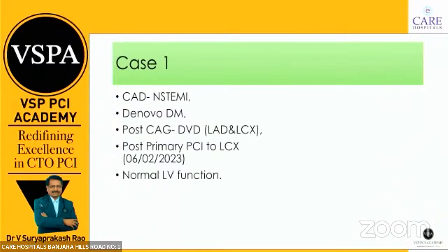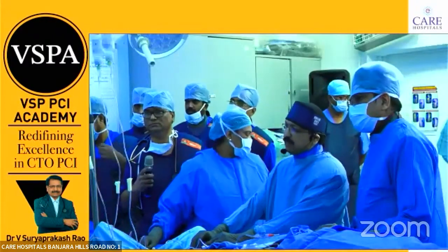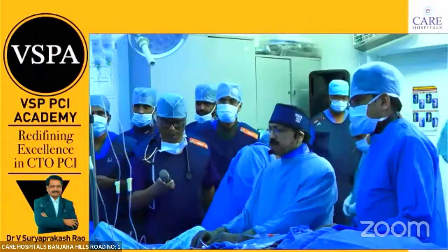The problem is he was stented in the circumflex in acute coronary syndrome at a different hospital. But at that time, the LAD CTO in the mid segment could not be profiled properly in different views to see exactly where it is. Now the dual injection is key for success.